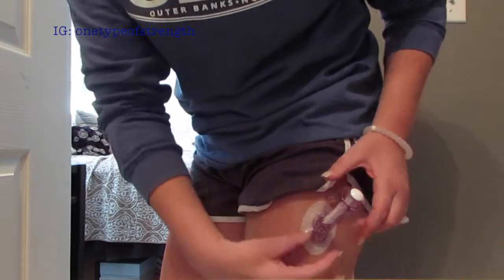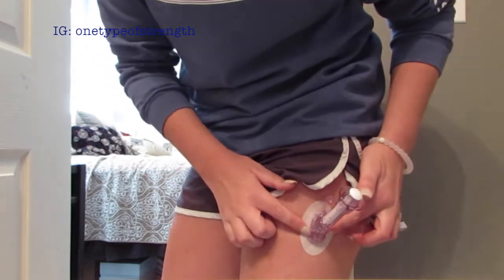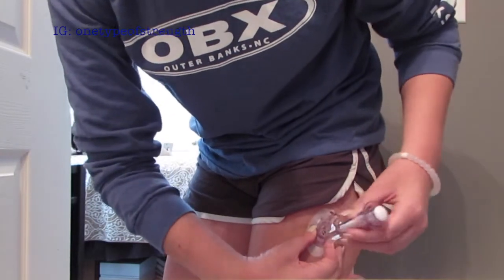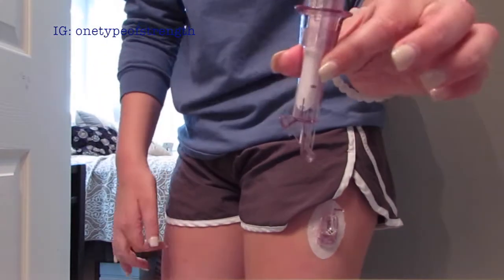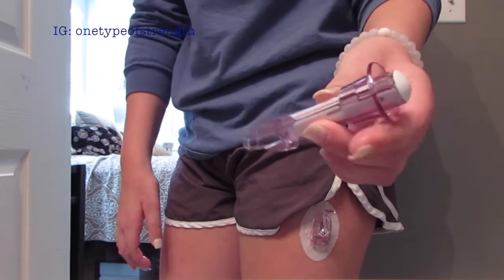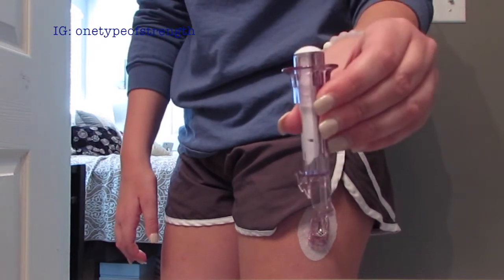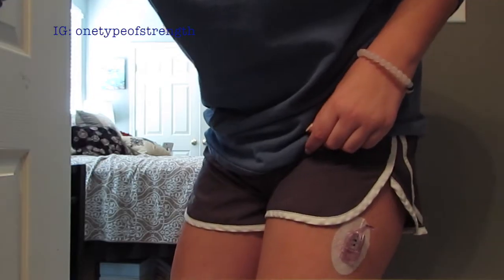That is now inserted into my leg. I need to remove the plunger — all you do is squeeze the two sides and then the plunger piece will fall out. You can just toss that part.